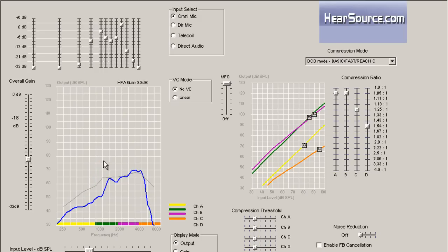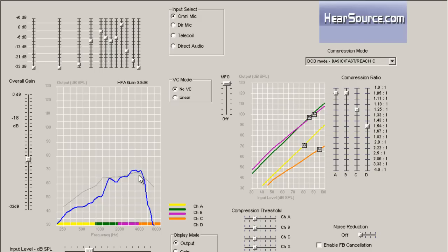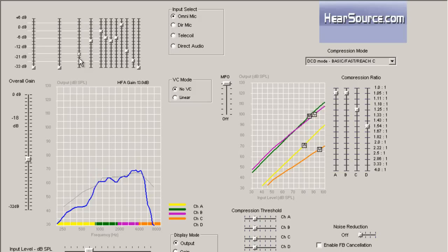You can also see down here on this output graph, the blue line is the output curve of your hearing aid. This is what the sound should be kicking out into your ear. And so as we're manipulating these sliders, you will see that line move.